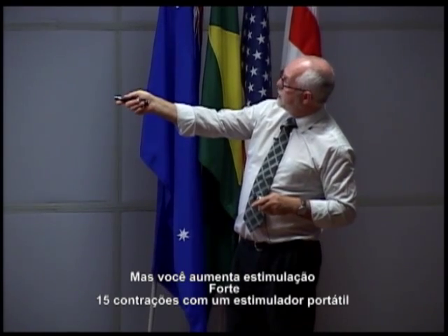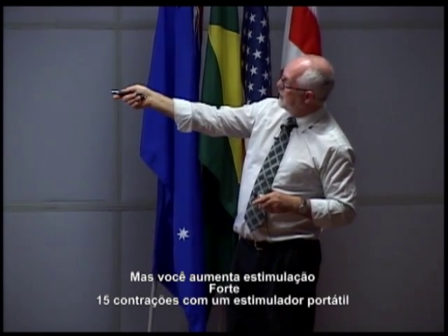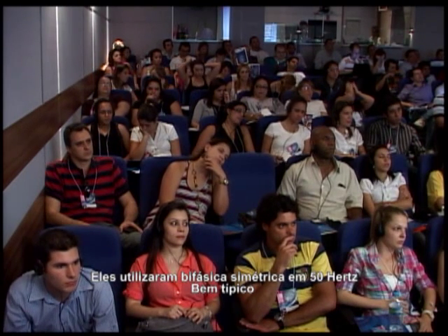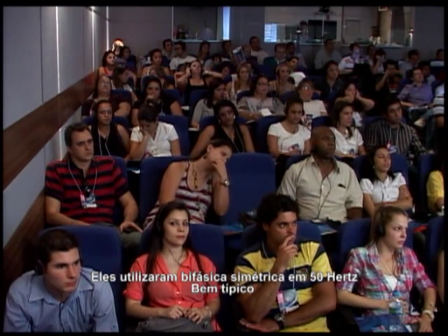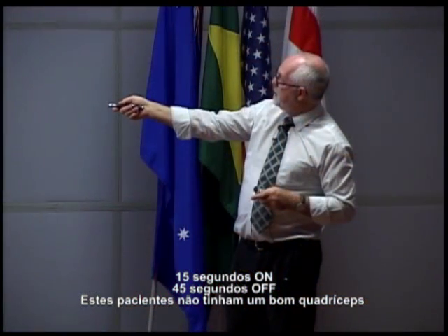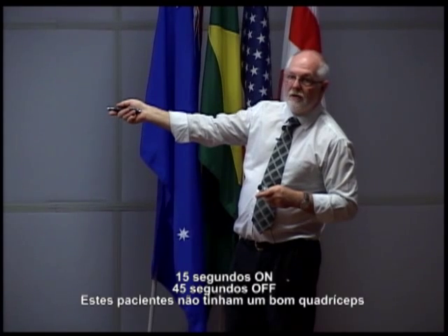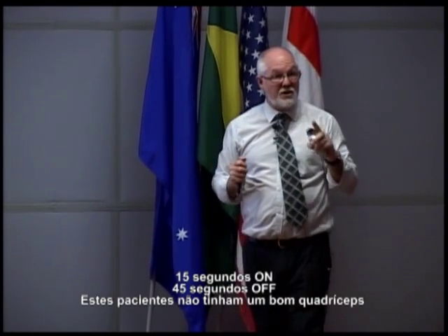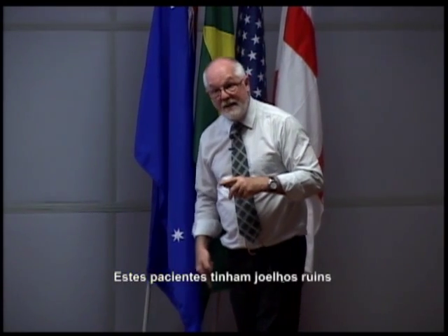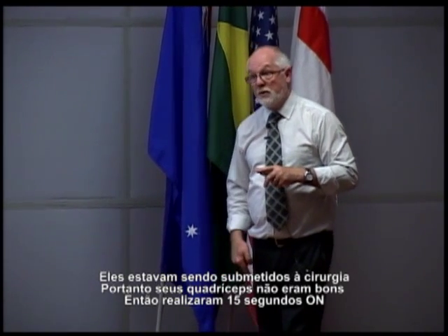15 contractions with a portable stimulator. They were using biphasic symmetrical at 50 hertz. Fairly typical stuff. 15 seconds on, 45 seconds off. These patients did not have good quadriceps. These patients had bad knees. They were going for surgery.